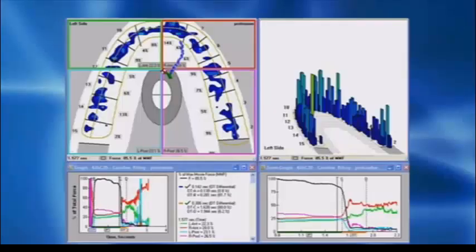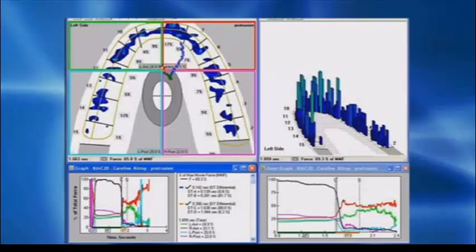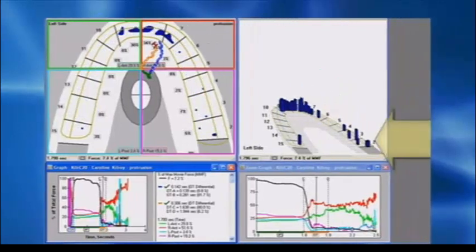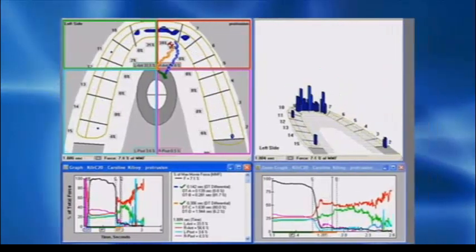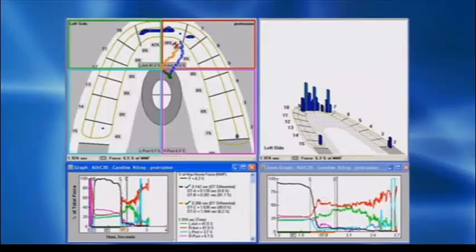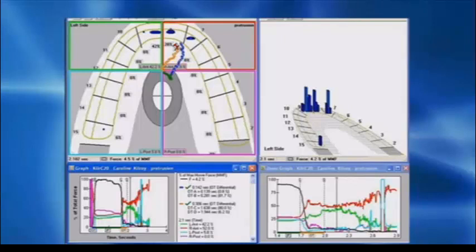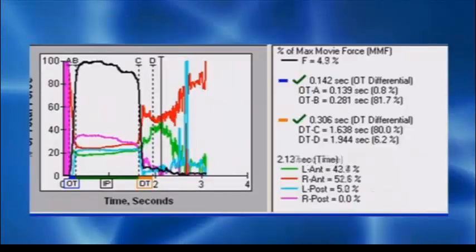And let's see about the protrusive movement. In protrusion, you reach your front teeth very fast. You're going forward, much more separation of your back teeth. This is the sensor folding up in the back. So that's not real contact. So you reach your front teeth extremely well, almost in no time. Let me see. 0.3 of a second again. So the only movement that has to be touched up is going to the right.